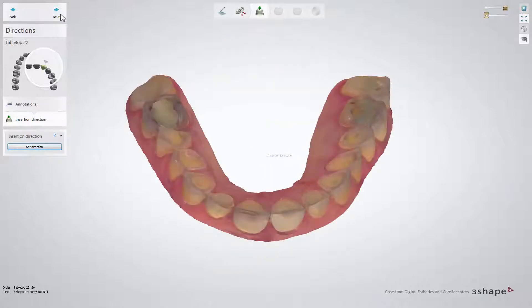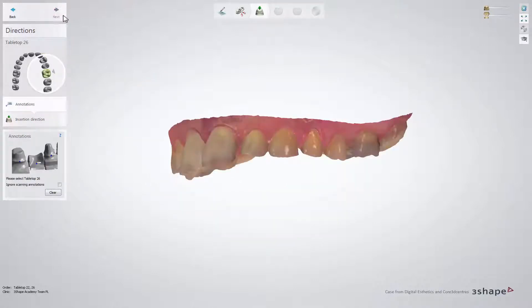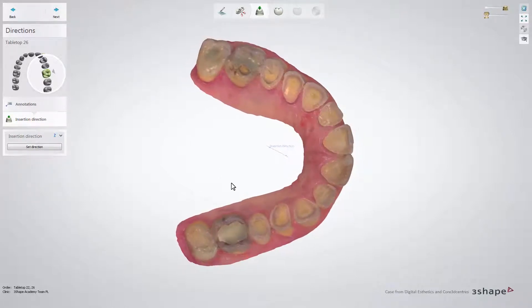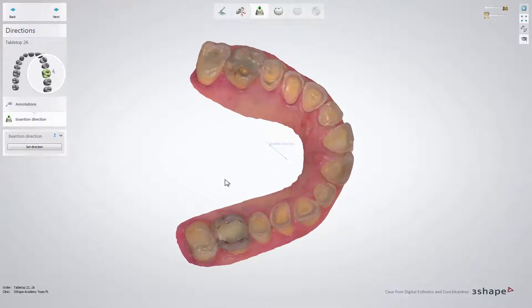If you have more than one tabletop or non-prepared veneer to design, the software will ask you to repeat these steps for all restorations. In this case, the patient is in need of more than two restorations; however, for demonstration, we will only work with two in this video.